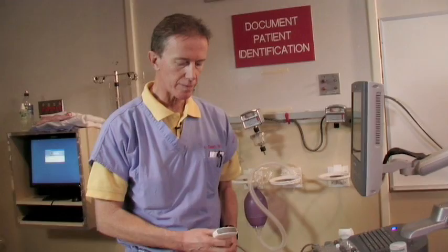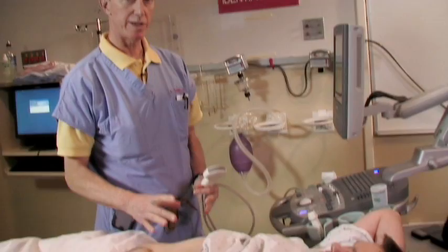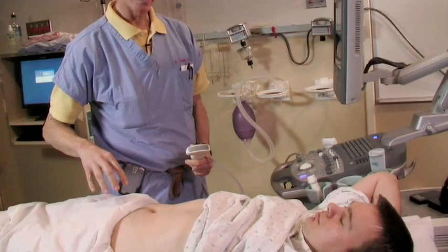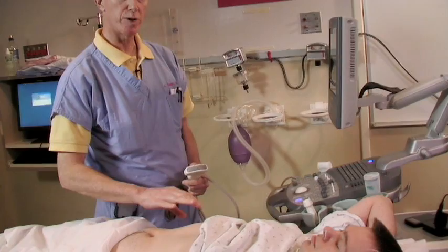As a preview, there are going to be 10 potential spaces that we will evaluate: four in the right upper quadrant, one in the subxiphoid area, four in the left upper quadrant, and one in the suprapubic area.